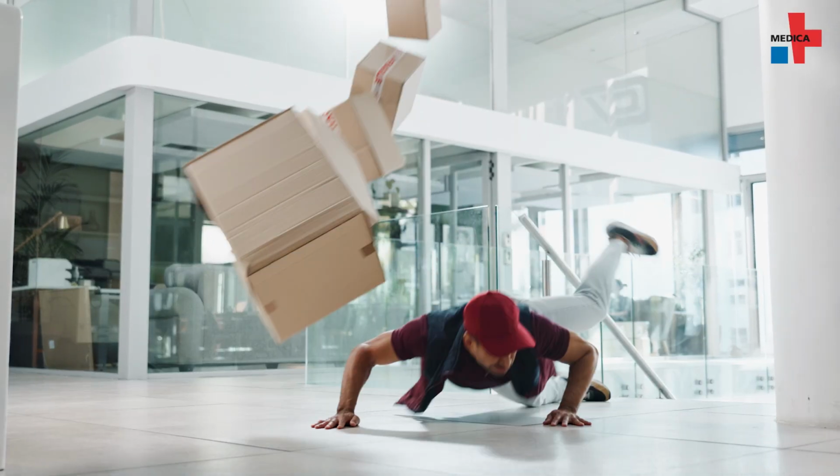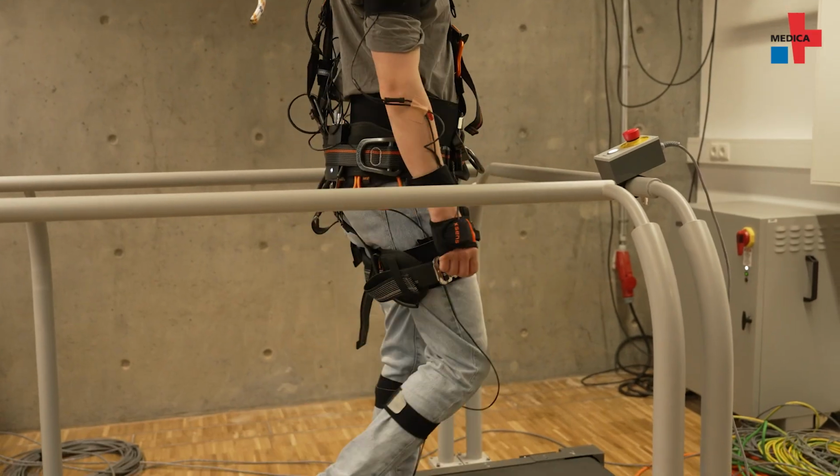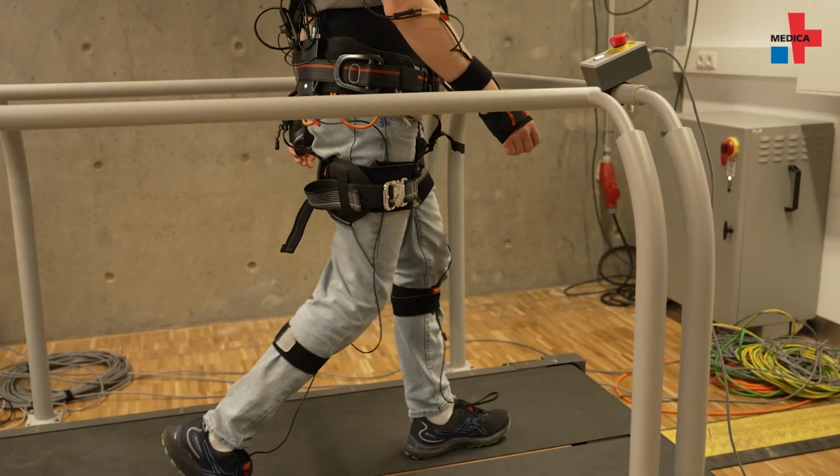Occupational health and safety is a major area of application for the project. Last year, we conducted a study with a major German parcel delivery company. In the area of occupational safety, it was about the prevention of trip and fall accidents. And there was a training course that was VR-based. In other words, you wore VR glasses and then walked on the treadmill, and suddenly the horizon moved and you had to get to grips with that.